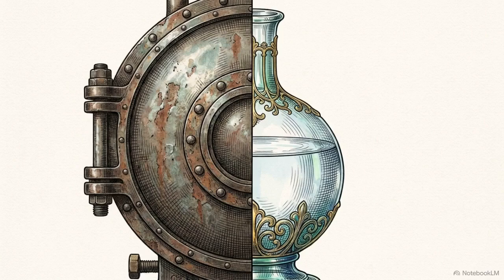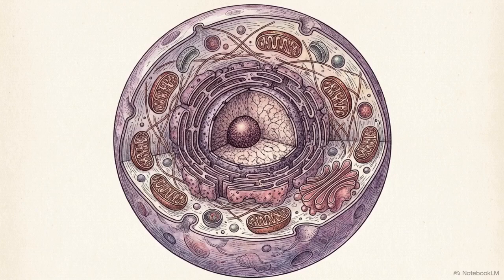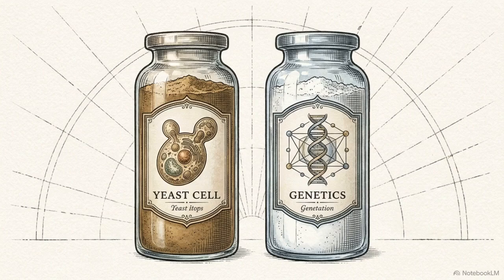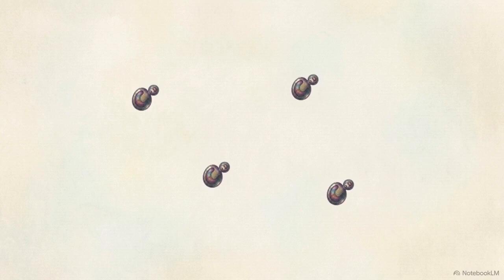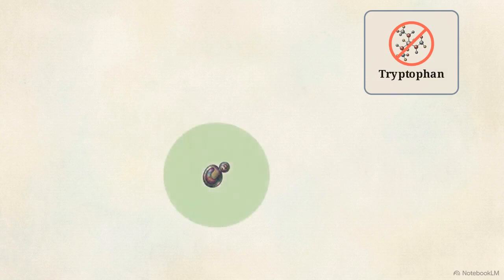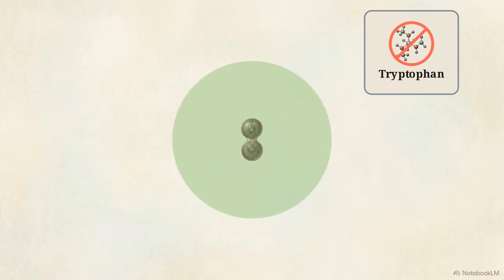yield high-efficiency biological factories. Culturing higher-order eukaryotic cells requires managing a significant increase in biological complexity. Eukaryotic cells possess a delicate internal architecture, including specialized organelles like the mitochondrion, the Golgi apparatus, and the nucleus. Even intermediate eukaryotes, like yeast, require highly specific media variants to maintain productivity, such as YPD broth or synthetic defined yeast nitrogen base. In yeast culture, researchers utilize deliberate biochemical omissions, such as CSM media without tryptophan, to select for engineered strains that have gained the genetic ability to produce that missing nutrient.